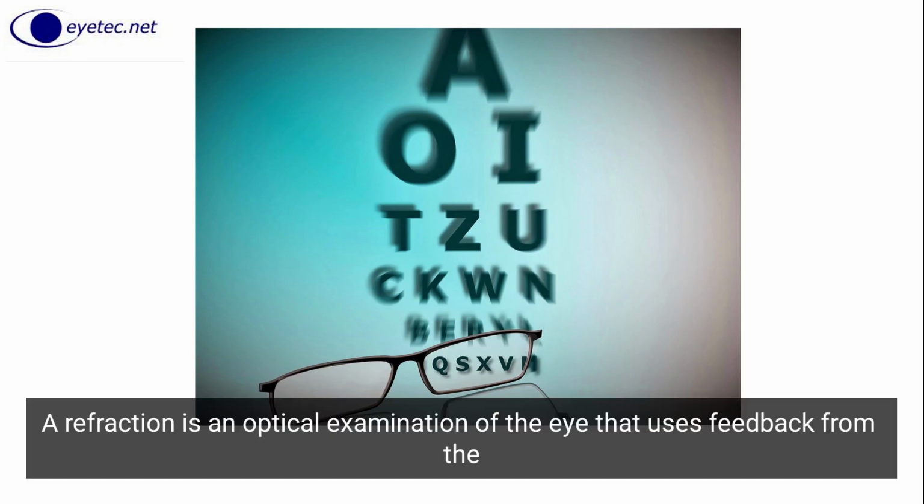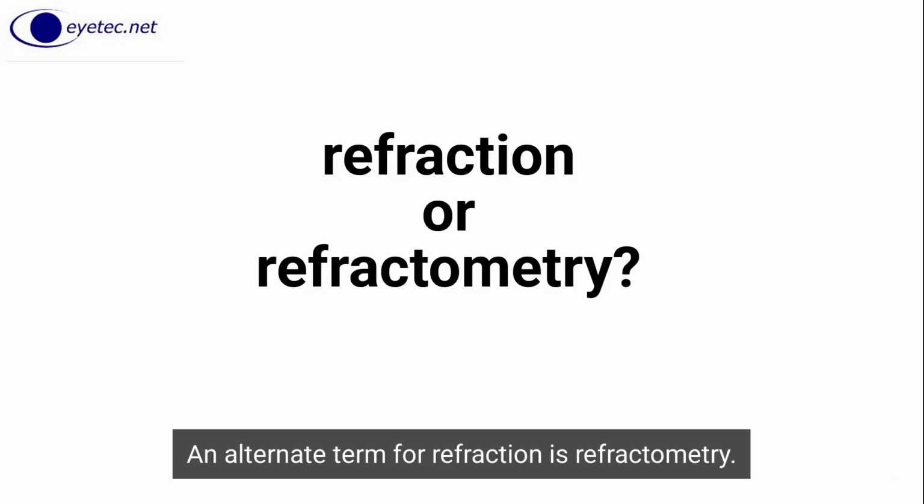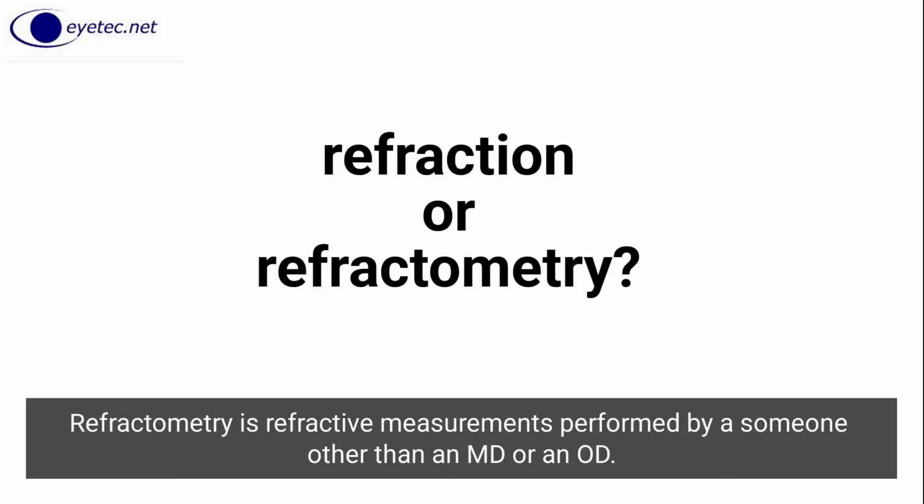A refraction is an optical examination of the eye that uses feedback from the patient to determine the optical correction for the refractive error of the eye. An alternate term for refraction is refractometry. Refractometry is refractive measurements performed by someone other than an MD or an OD.